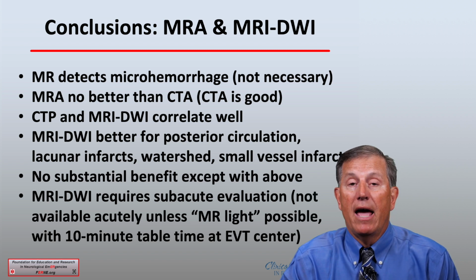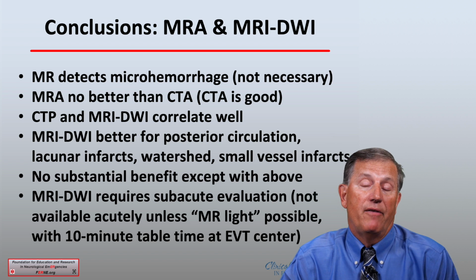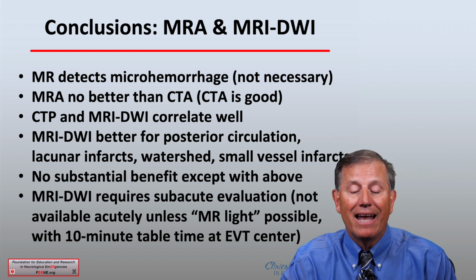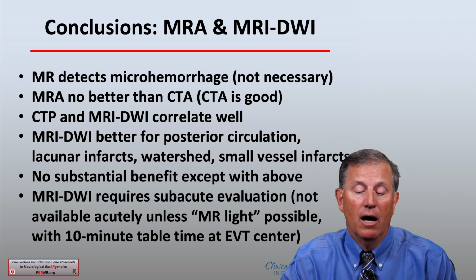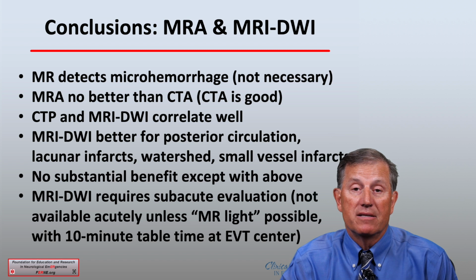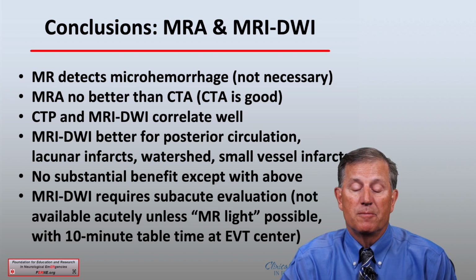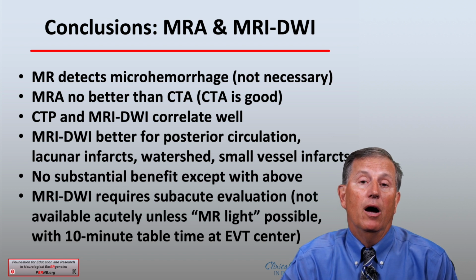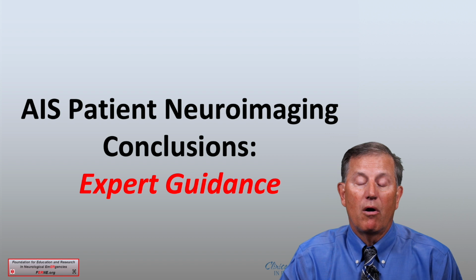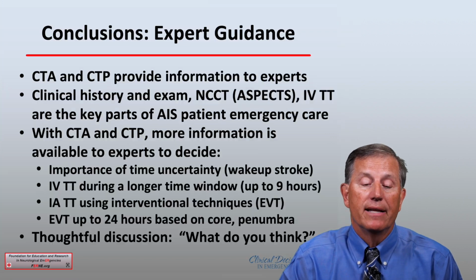And we do know that MR DWI requires that the evaluation and testing be done in the subacute period, not in the acute period, unless there's the availability of MR Lite, which may be available in the acute setting of some specialized center with a 10-minute table time at an EVT-capable center. So what are our conclusions regarding expert guidance?